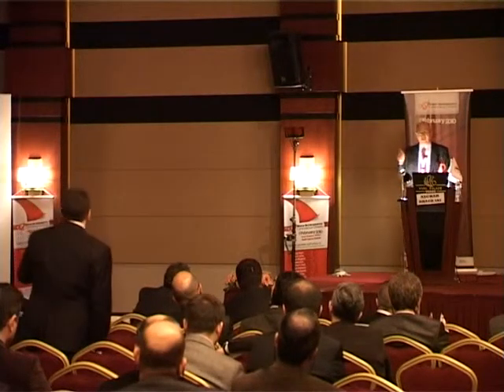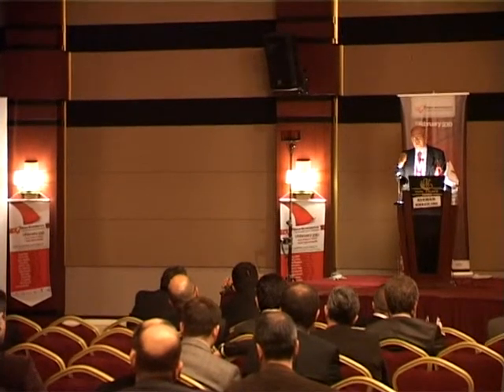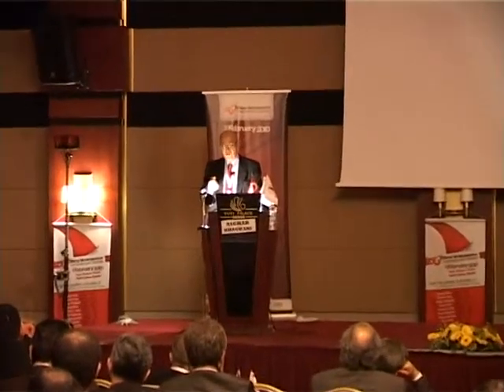The first one, they're not using cardiopulmonary bypass, they're not using the cardioplegia for inserting the device. It's something that we do, and some other centers do. Actually, we do sometimes beating heart, because the heart is absolutely empty. We have got a big hole, we put the sucker there, the heart is empty, and it wouldn't eject. So you can do that, the heart actually is beating. I prefer nowadays fibrillating the heart, because you can examine inside the heart for the clot and everything else. You can use cardioplegia. There's no real rule about that.